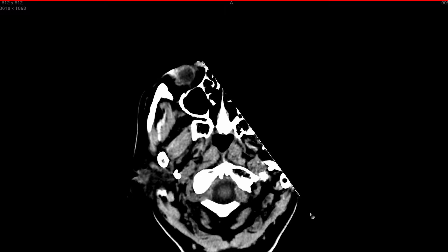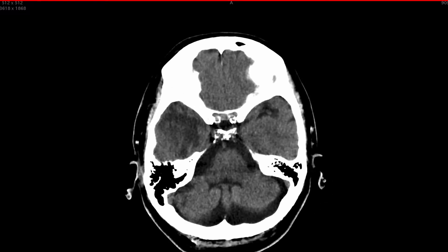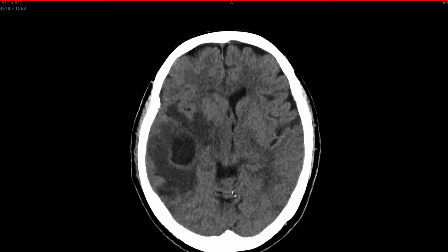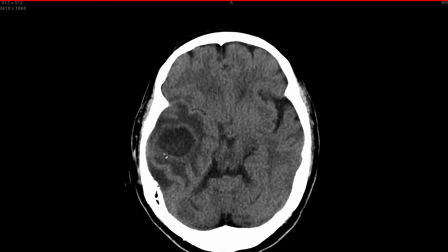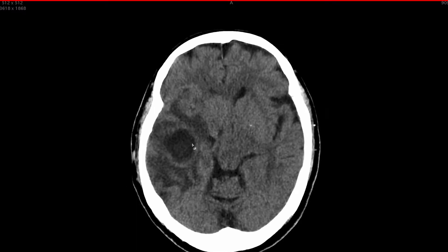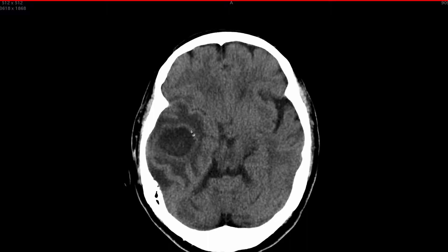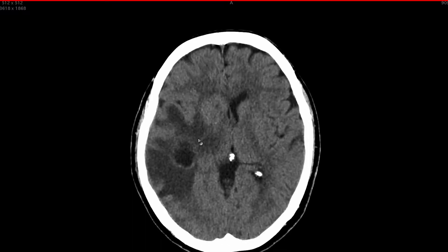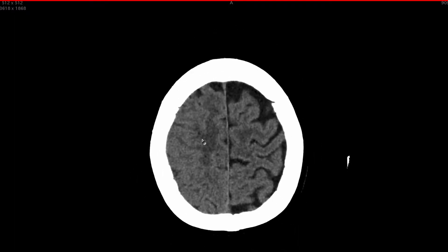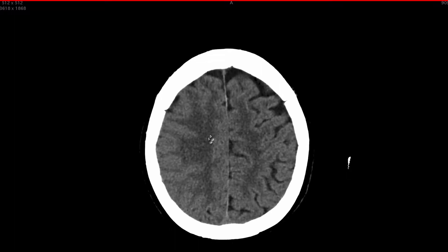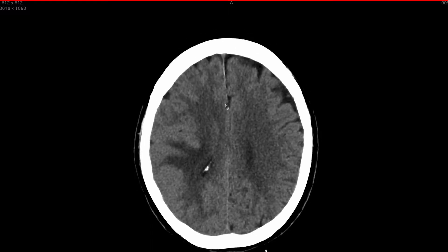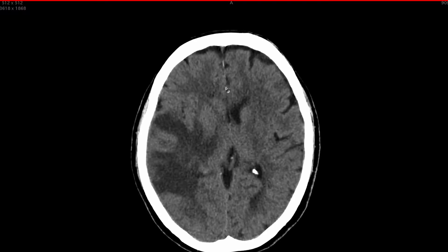We start off with a non-contrast CT scan of the patient's brain. Starting at the bottom and making our way to the top, we can immediately see there is a large abnormality in the right side of the patient's brain, localized to the right temporal lobe. The abnormality is characterized by a well-circumscribed ovoid lesion with a thick hyperdense wall, low-density center, and low-density changes in the surrounding cerebral parenchyma. There is mass effect resulting in effacement of the sulci of the right cerebral hemisphere, with left deviation of the midline. You can see that the falx is deviated to the left.